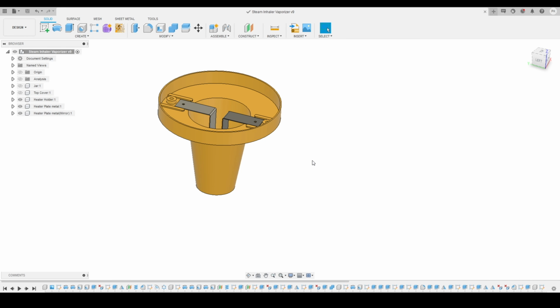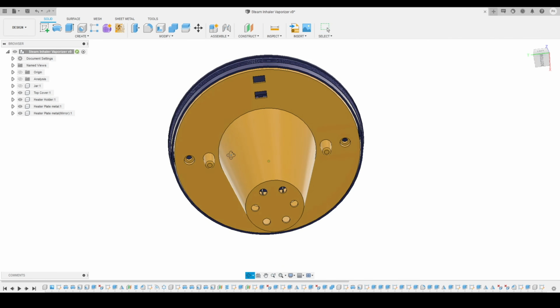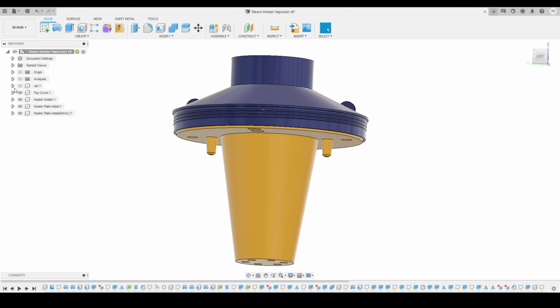I hope you liked this tutorial so far. Because this is a little longer tutorial, it is also a very detailed tutorial, that's why it took me a little longer to finish these models. So here you can see this is our final result. And if I turn on the top cover, here you can see it will look something like this, and if I turn on the jar, it will look something like this.